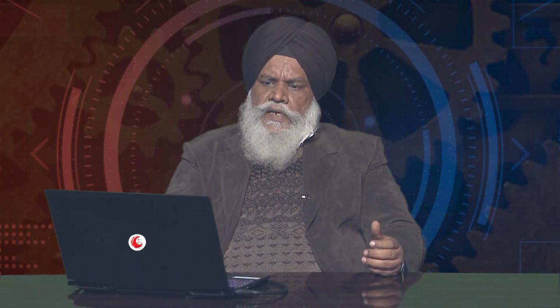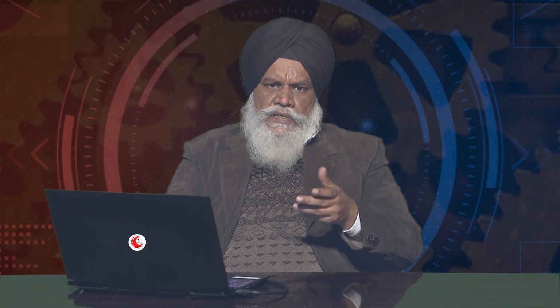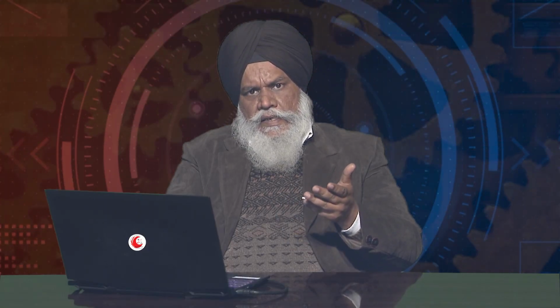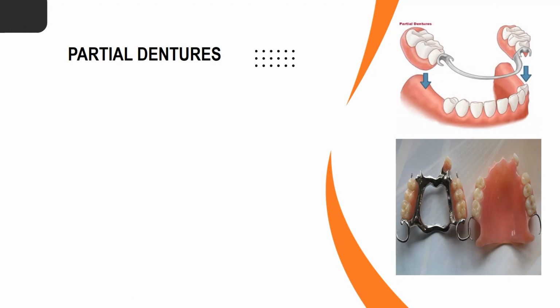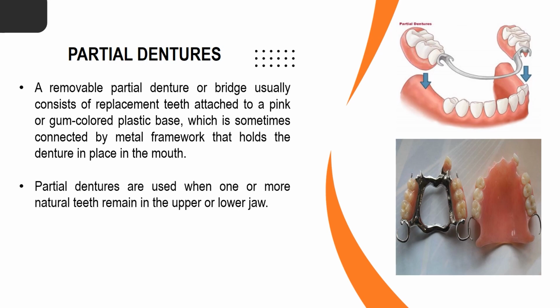So we have dentures for complete and removable, partial as well as full. The upper arch is called maxilla and the lower arch is called the mandible. If only some parts are being replaced, then it is the case of a partial denture.